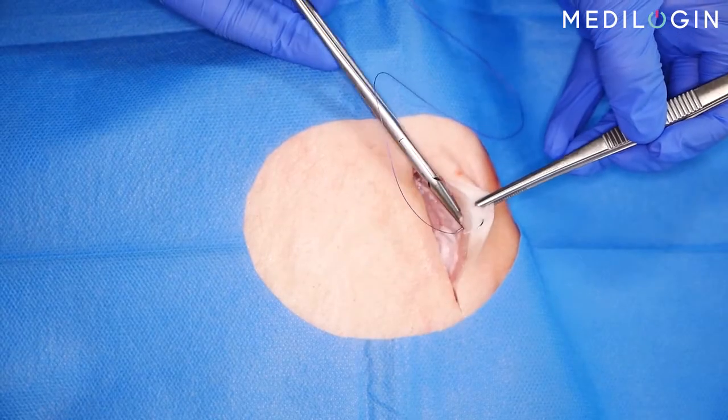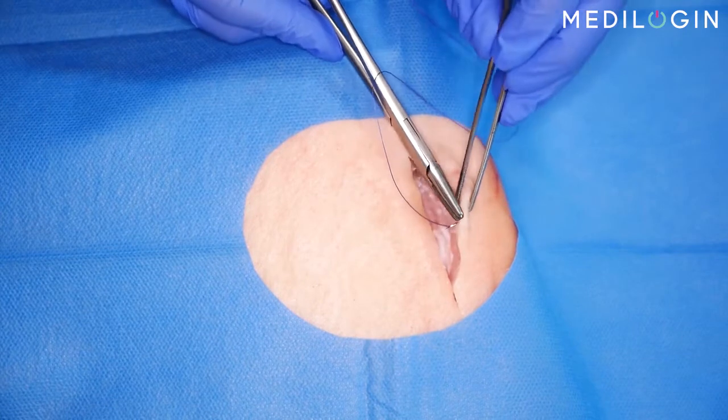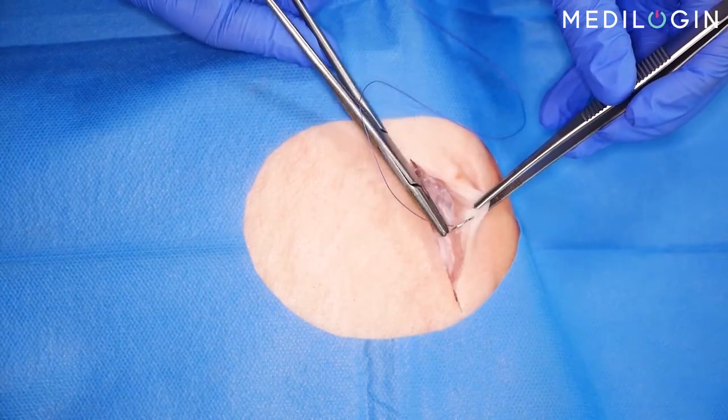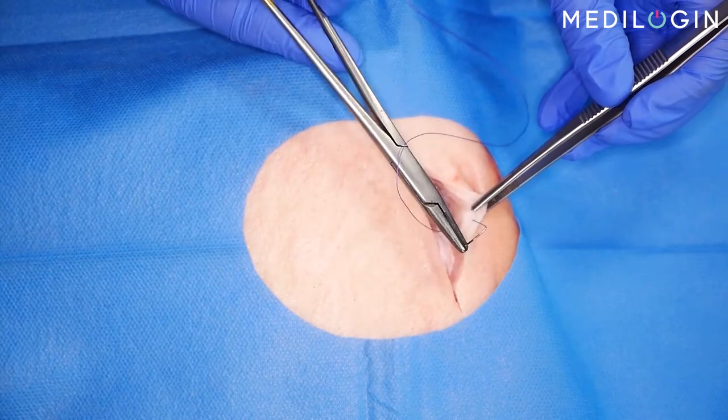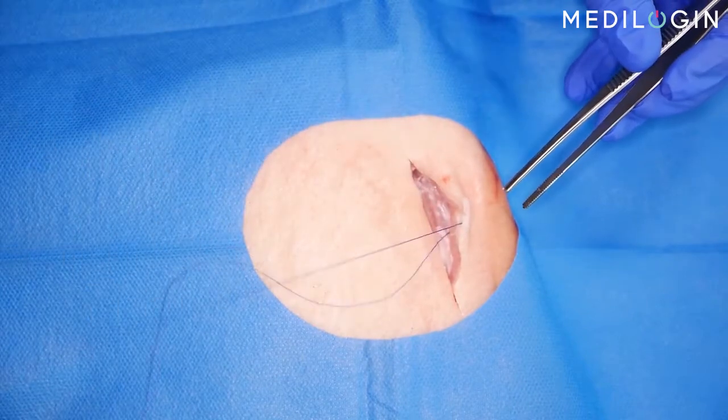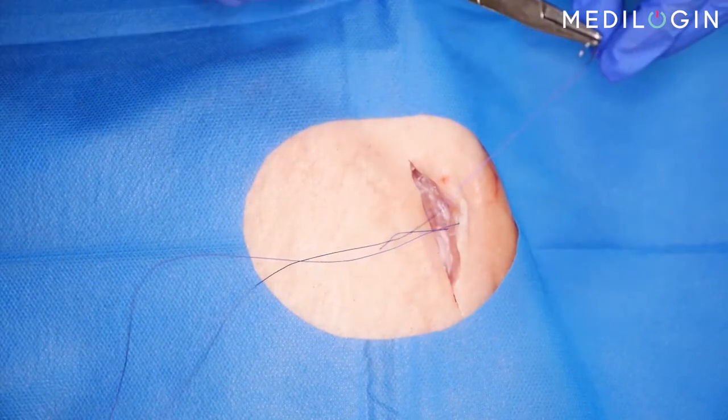Start in the middle of the wound and set the first stitch in the depth of the subcutis. Use a 180-degree supination movement to guide the needle into the upper subcutis. Do not grasp the needle with the needle holder at the tip, but slightly higher.